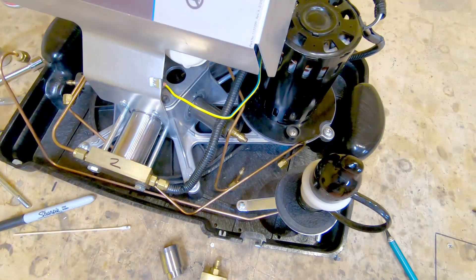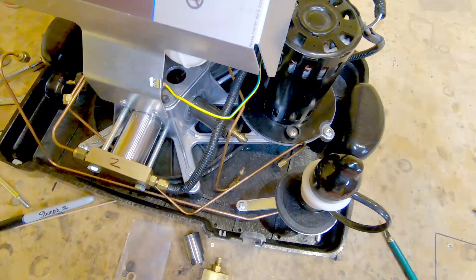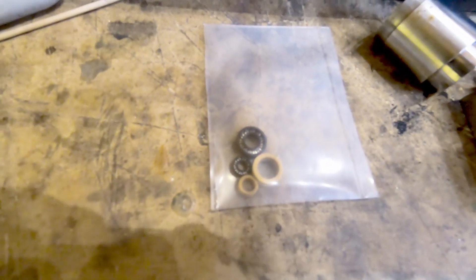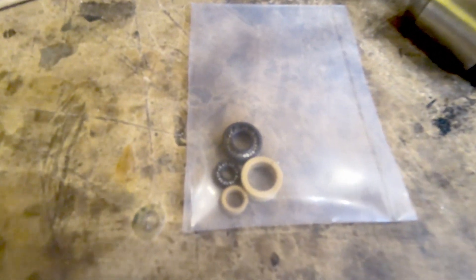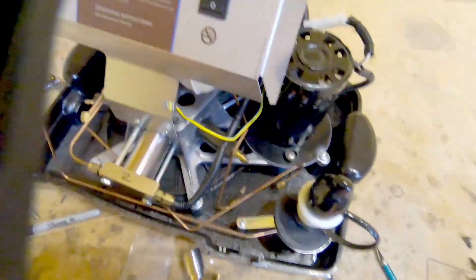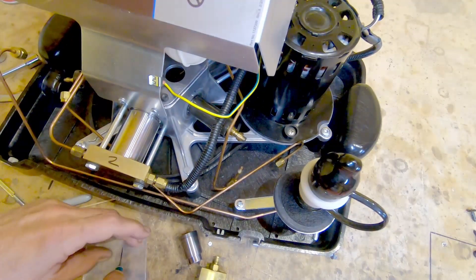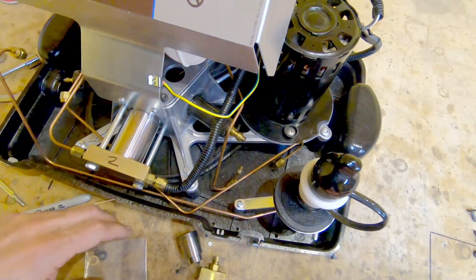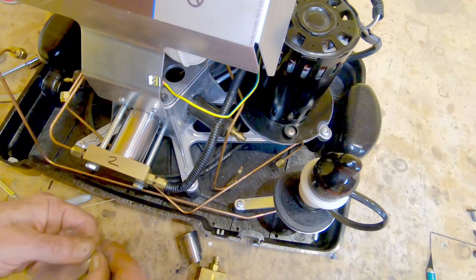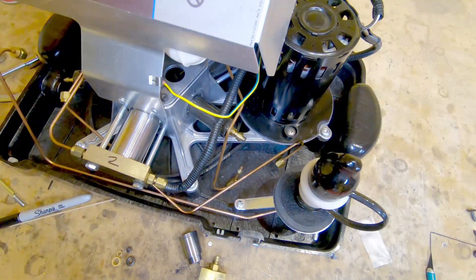Now I'm going to go get the little seal kit. These guys are available from a seller on eBay, and I think they may also be a semi-standard industrial product. But I've read that one guy actually did try to find these from an industrial supplier and determined that they're similar but not identical — they actually are special.